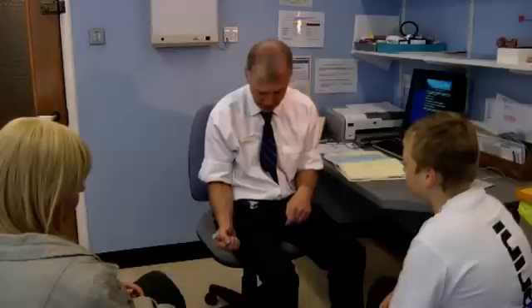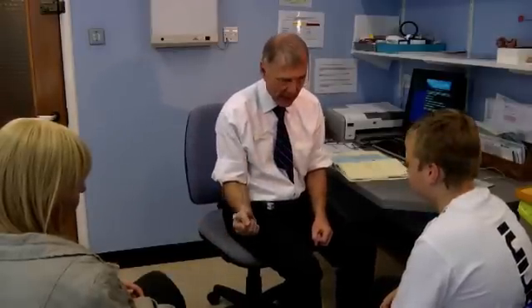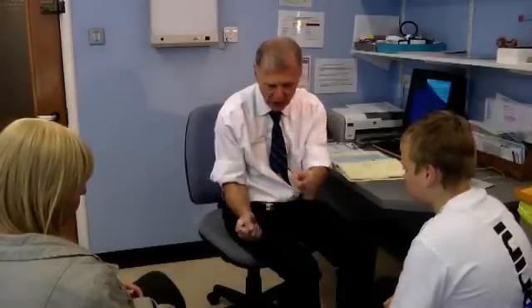So what we do is hold it in a fist and put the EpiPen in position. Then there's a grey safety catch on the top — we take the safety catch off. Now it's like a safety catch on a gun; it can fire. We've got it in the right position already to go. Then it's a little swing — watch and listen carefully, you'll hear it click when it hits the leg and goes in.